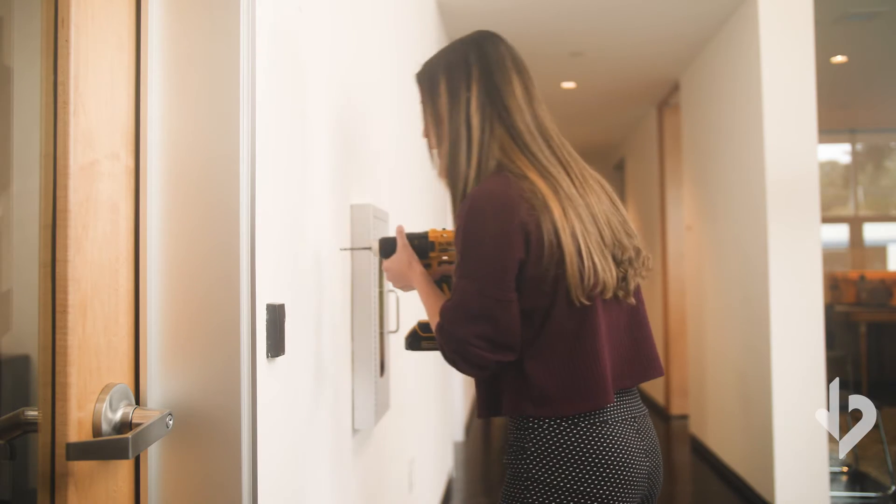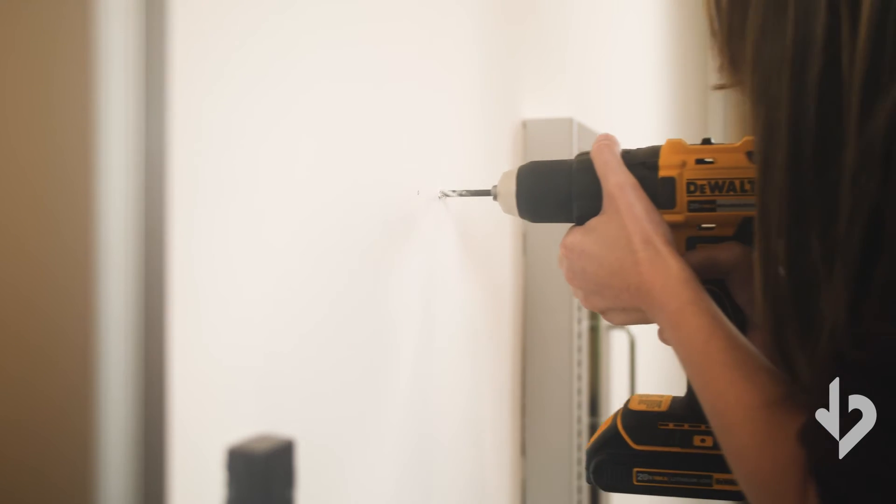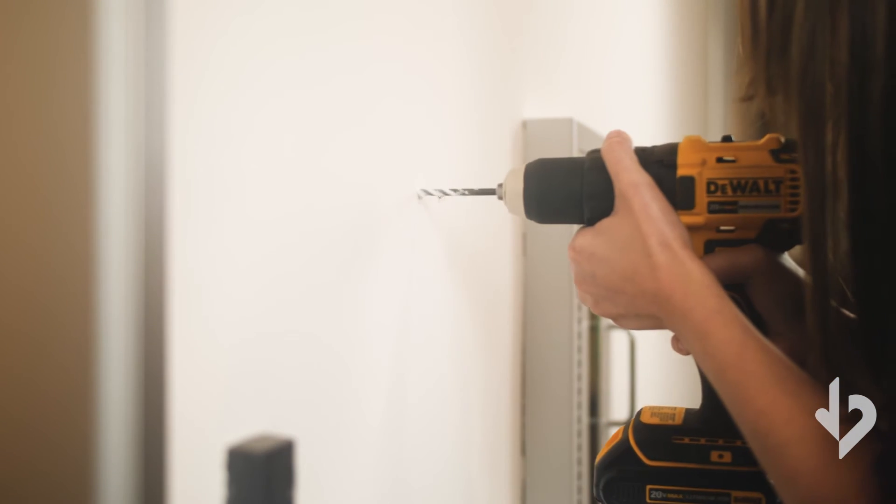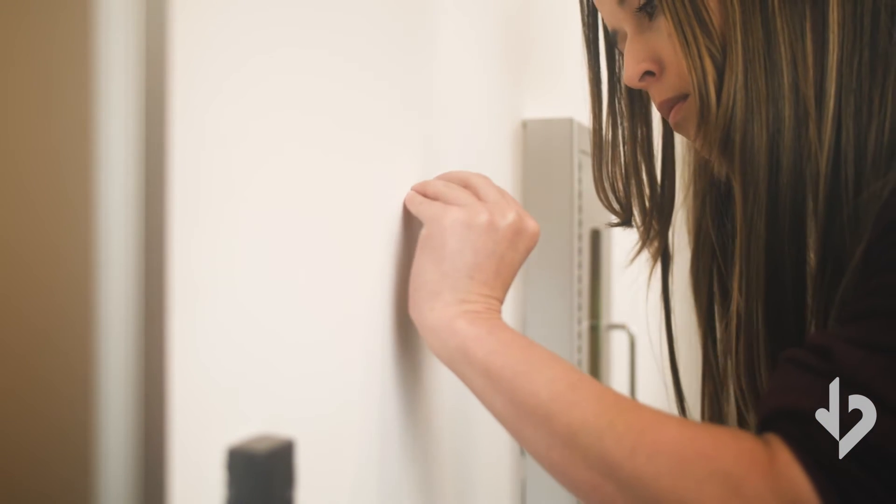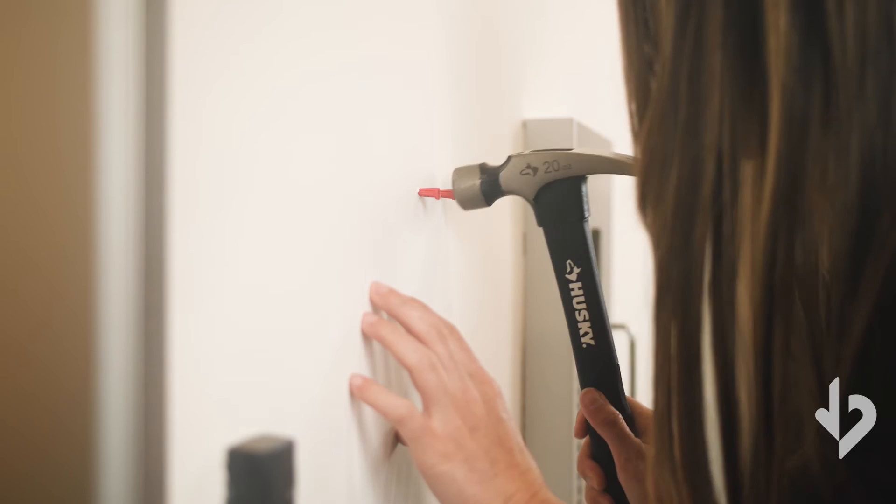Use a 3/16th drill bit, drill holes where marked. Insert the two anchors so that they're flush with the wall.